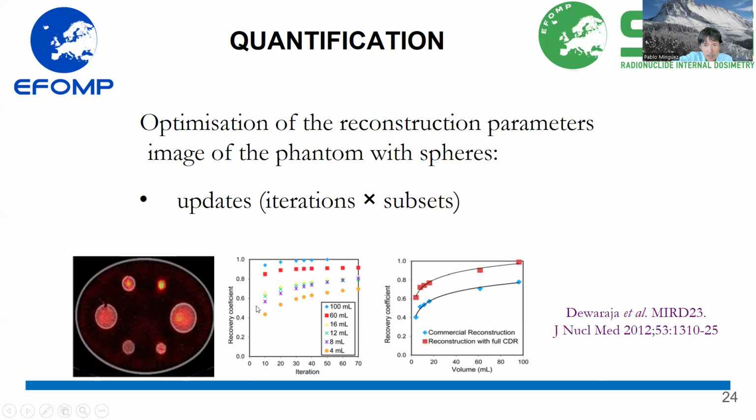We can see that as the number of iterations increases, the activity is better recovered. But there's a point at which the improvement is not that relevant, and we only increase the noise in the image.